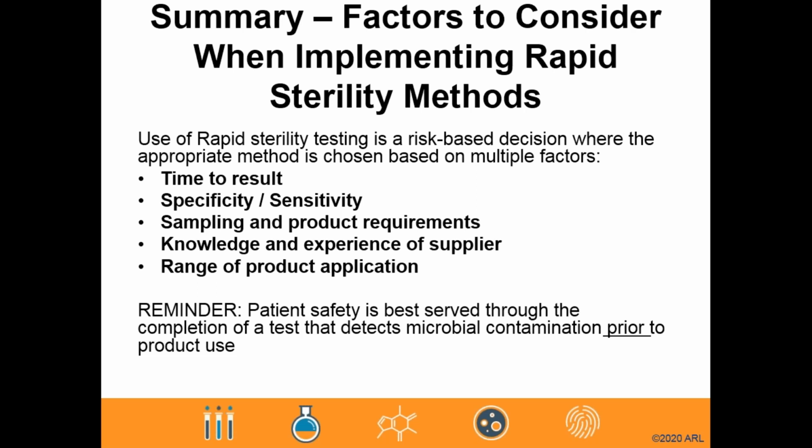Multiple factors, including time to result, specificity and sensitivity, product applications, sampling requirements, as well as knowledge and experience of the testing lab, must be taken into account when considering the implementation of rapid sterility testing.